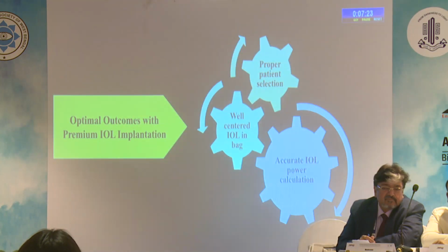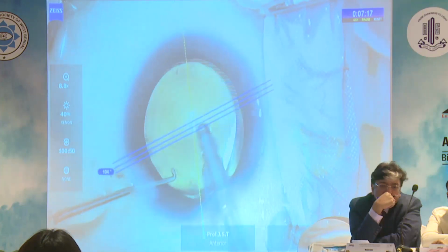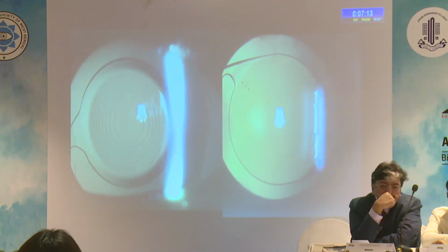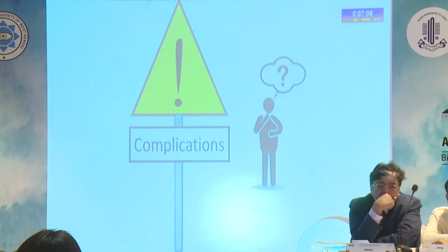Proper patient selection, precise IOL power calculation, and a well-centered IOL placed within the capsular bag are prerequisites to achieving optimal outcomes in these premium IOL implantations. But what do we do when things don't go as planned?